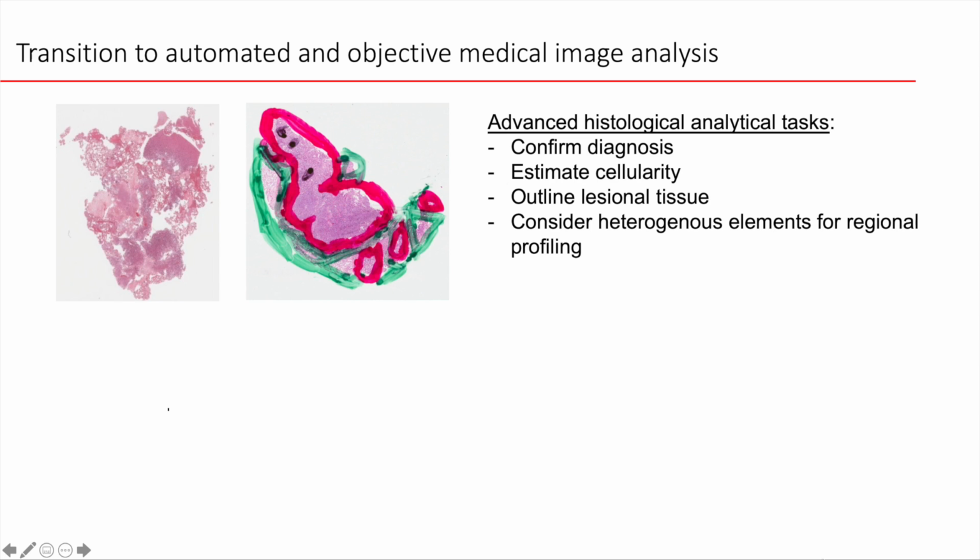And in some specific cases where the question revolves around tumor heterogeneity, of course, there could be instances where I need to circle both the epithelial and stromal component of a tumor. And these, of course, are done mostly with a magic marker, as shown here, as I'm sure most of you know, which is quite outdated in today's digital society.